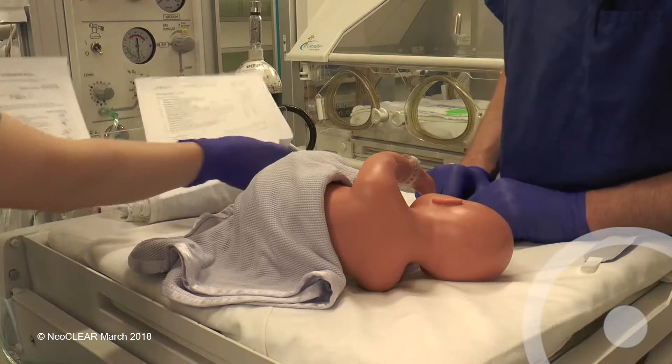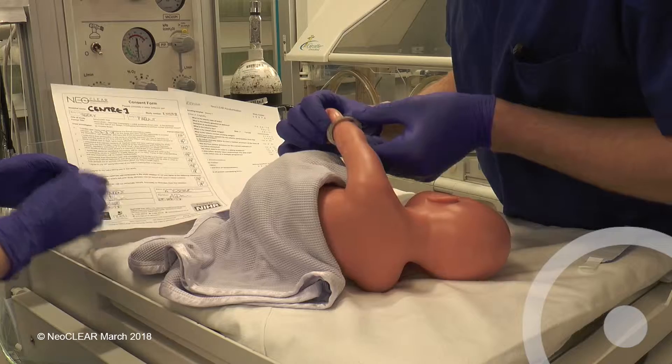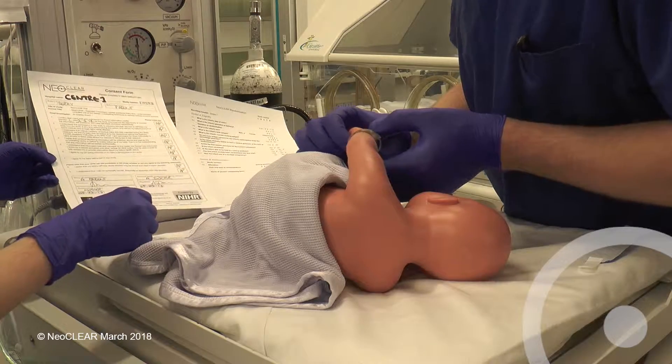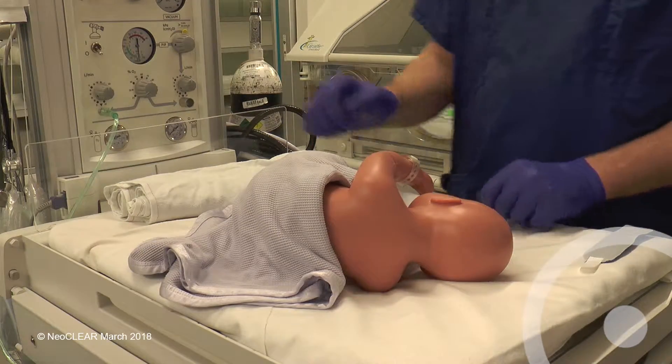Before starting, check the consent form and bring the printed allocation from randomisation. Confirm identity and allocated technique with the assistant. Assistants should wear non-sterile gloves. The area should be warm and well lit.